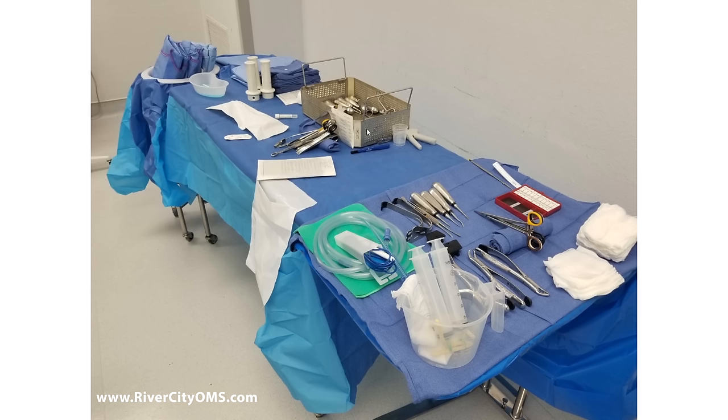More instruments that we're probably not going to use during the case, but basically what you see here are a whole bunch of different types of these dental elevators that I showed you a minute ago. This thing right here is a molt mouth prop. I told you these bite blocks fit between the teeth to hold the mouth open. Well, this thing has basically flat ridges that you can't quite see that fit against the top and the bottom teeth. And when you squeeze this together, it cranks the mouth open. So in patients who just cannot open their mouth because of the infection, this is real handy.